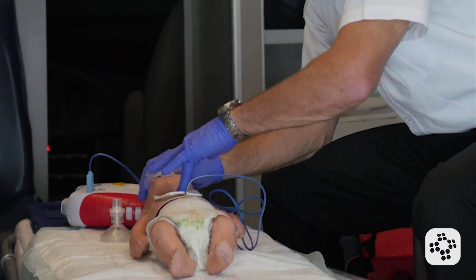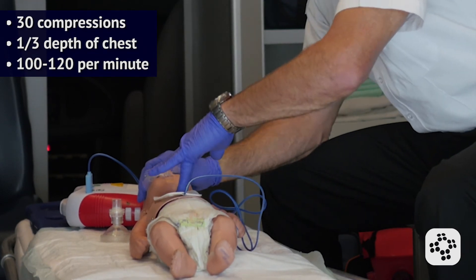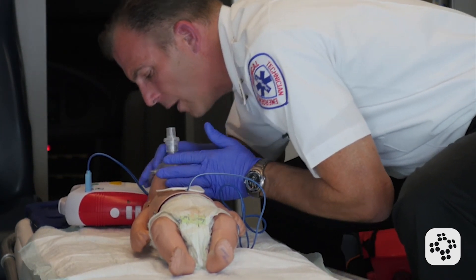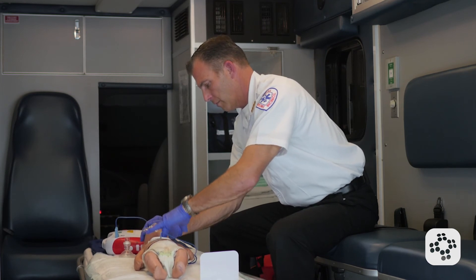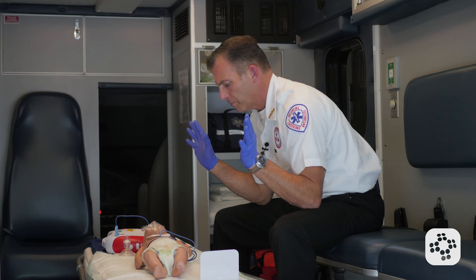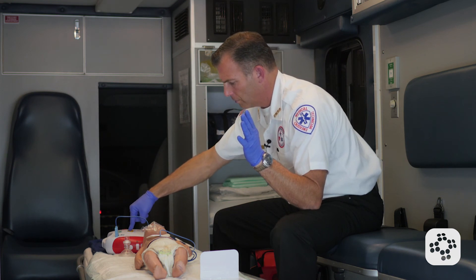Compressions are done right over the AED pads and I will not remove them. The AED then prompts: stop touching the patient, let the AED analyze. Shock advised. Charging. Everyone stand clear. Push the shock button. Shock delivered.